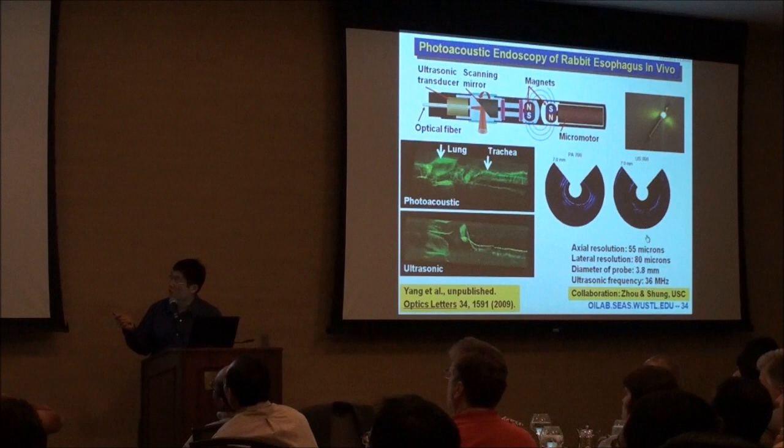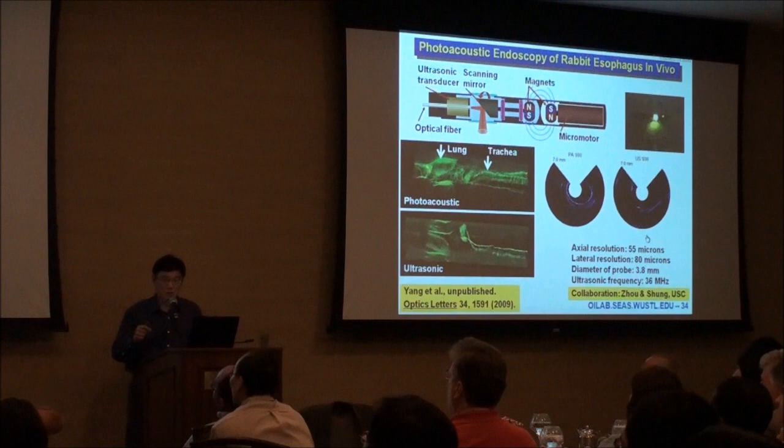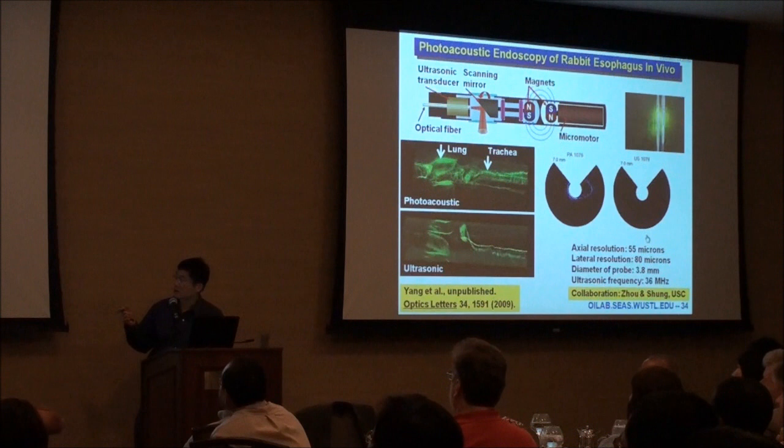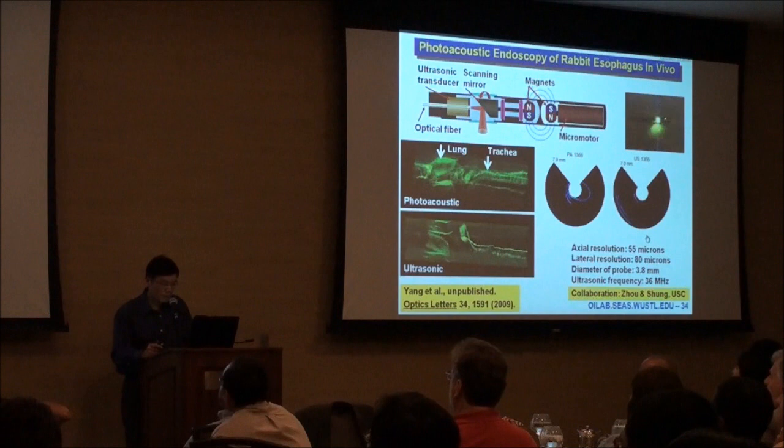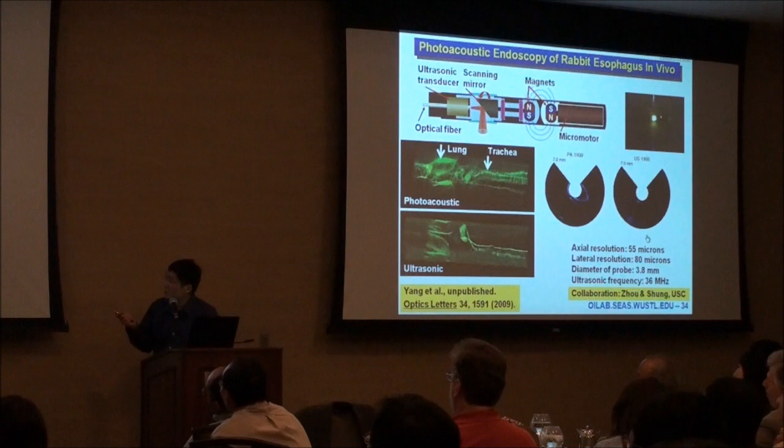Now, ultrasound transmission has to be liquid coupled. It doesn't like air. This micromotor doesn't like liquid, so this side is hermetic. We transfer the torque through this pair of magnets. You see this device in action. So we tested this device in a rabbit esophagus in vivo. As you pull back, you can see the features in the rabbit esophagus.